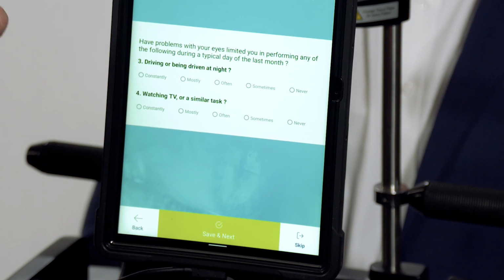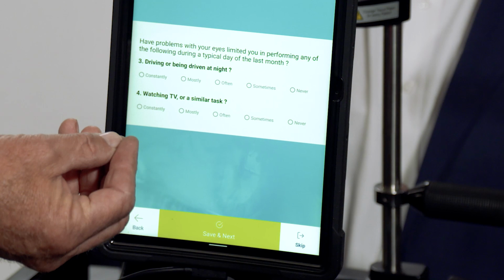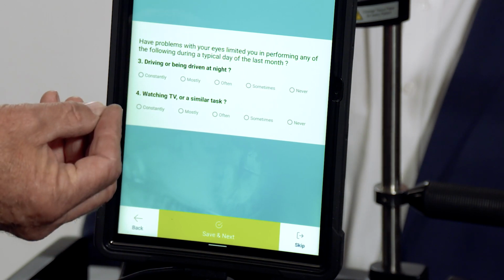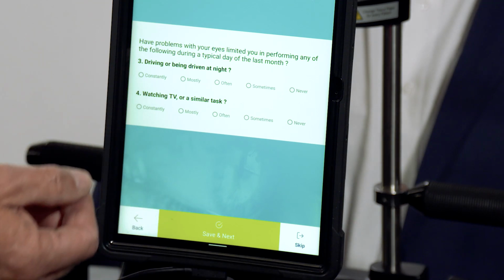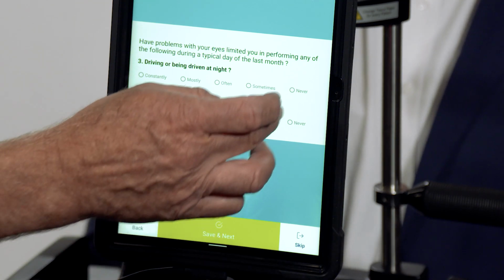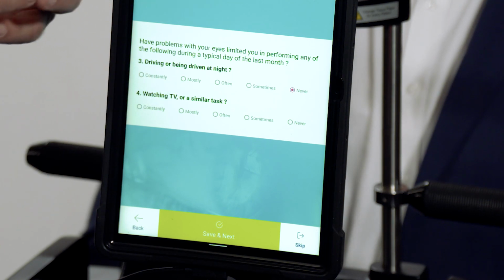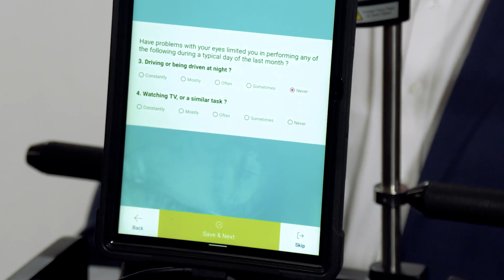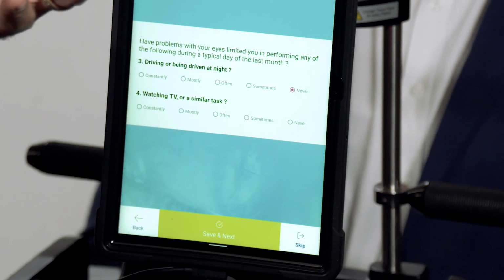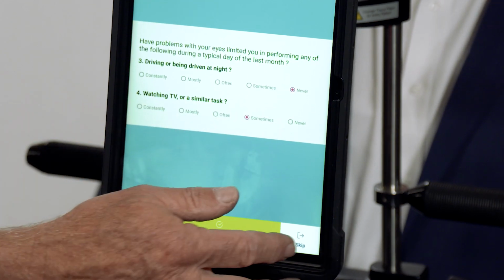Then the next question is, have problems with your eyes limited you performing any of the following during a typical day in the last month? Driving or being driven at night? Never. Watching TV or a similar task, and I want you to think about this being in front of your iPhone or your tablet or a PDA of any type? Sometimes. So we're going to save that.